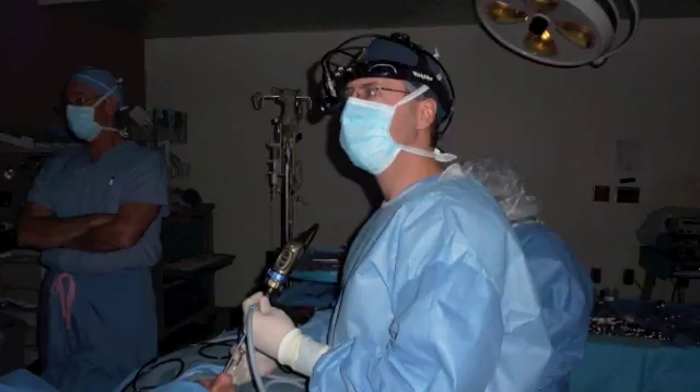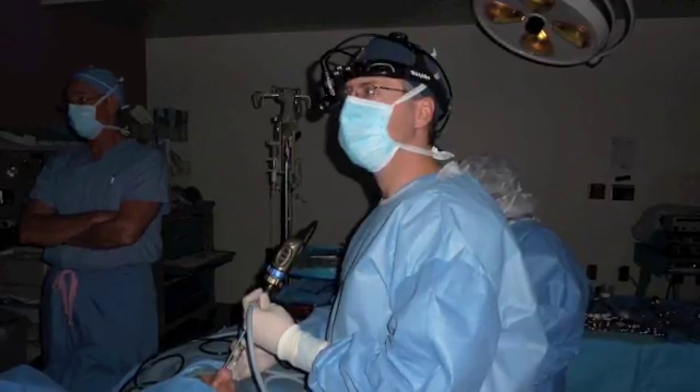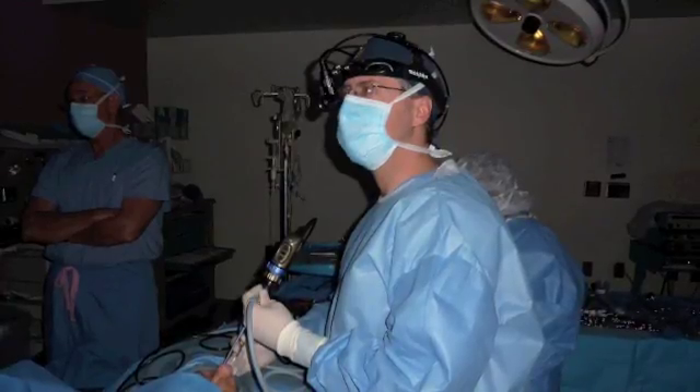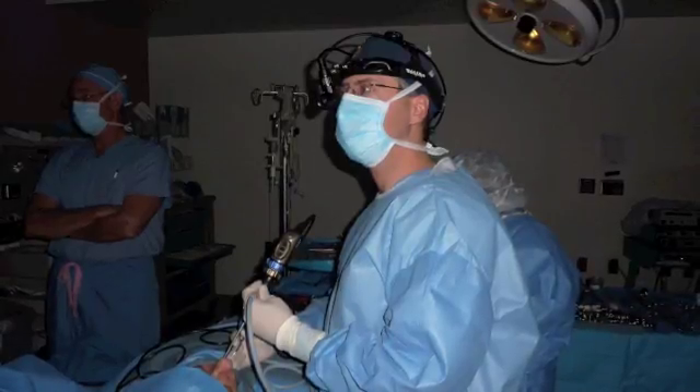Hello and welcome to this video where we will discuss how to perform ligation of arteries in the nose that are causing severe nosebleeds or epistaxis. My name is Steven Hauser. I am an otolaryngologist, specifically a rhinologist in practice in Cleveland, Ohio.